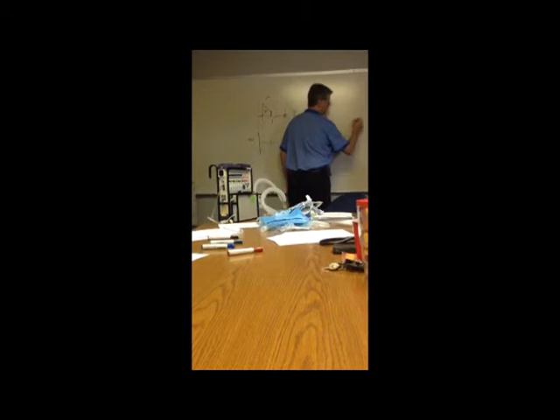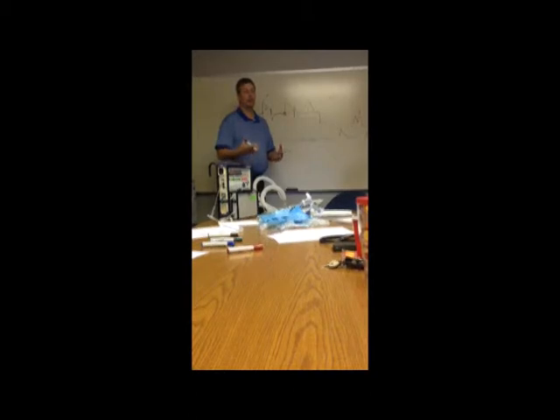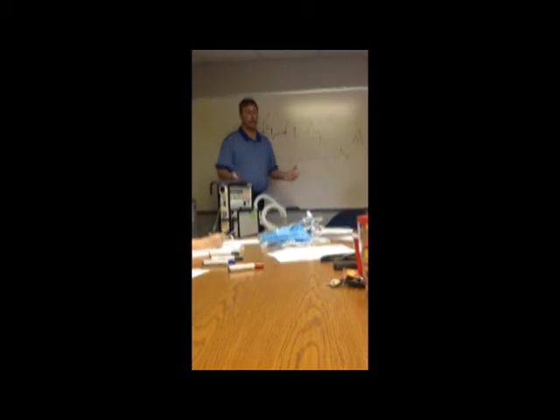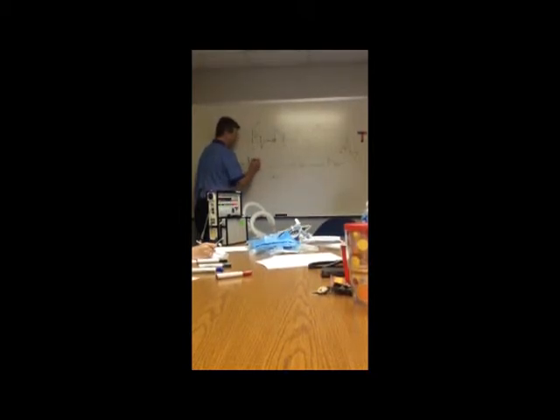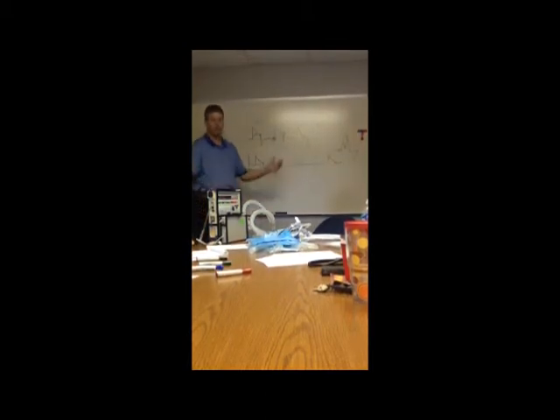And the reason you do that is, as I'm going to draw it up here, you don't want the patient starting a breath and then the machine giving them a breath right behind it and stacking breaths. So it eliminates double breaths or stacking. It synchronizes with the patient, so they're not exhaling when the next one shoves in their throat or the other way around. Okay? So, on IMV, you have 8 breaths a minute. Machine starts out, gives a breath, lets them exhale, and then say here's the next 7.5 second mark. That's when the next breath is going to be delivered by the machine.